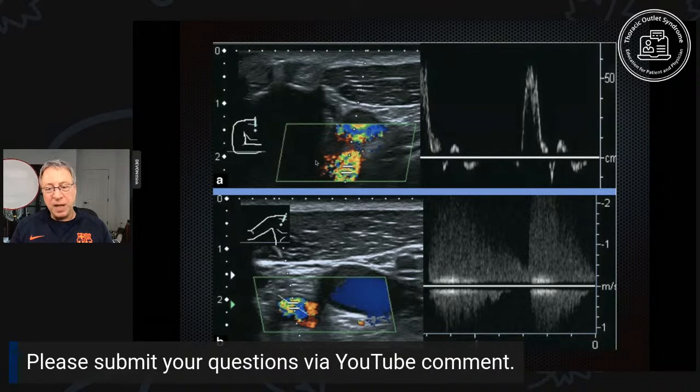So it's a very high velocity and it's very turbulent blood flow. So this is good. It's real time. It shows us the artery is being compressed and it doesn't need the radiation that an arteriogram does. And it doesn't require the dye or contrast that the arteriogram does.